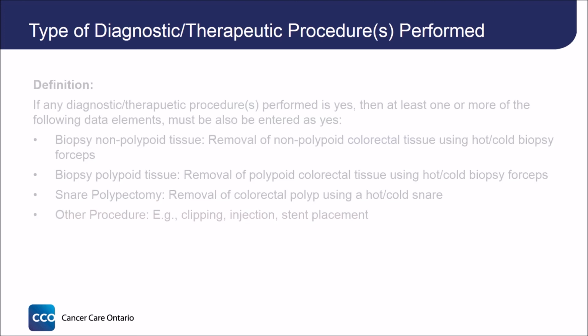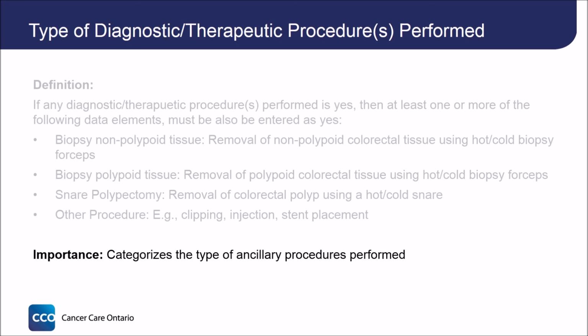If a colorectal cancer is identified and biopsied, indicate yes for biopsy polypoid tissue. This data element provides information on the type of diagnostic or therapeutic procedure performed. In particular, it will provide important information about the management of polyps.